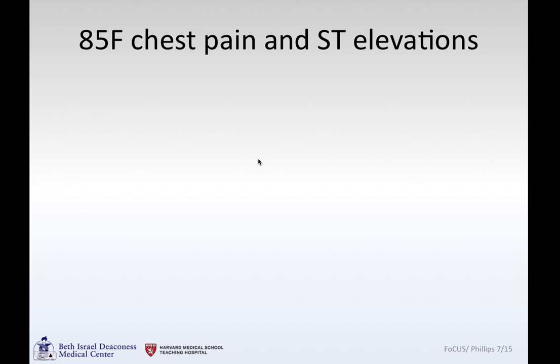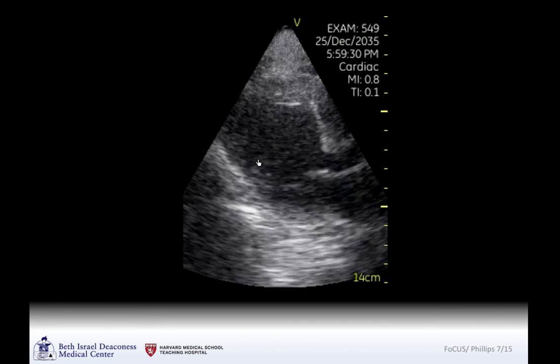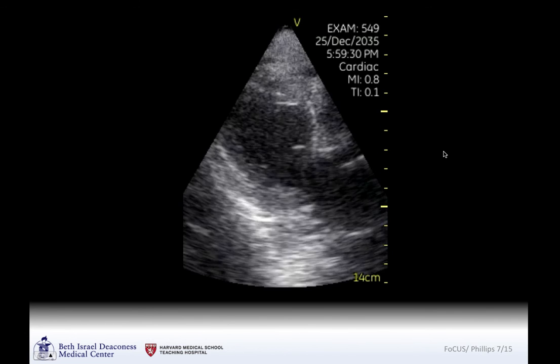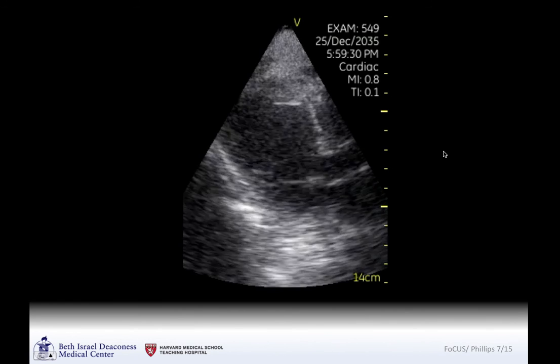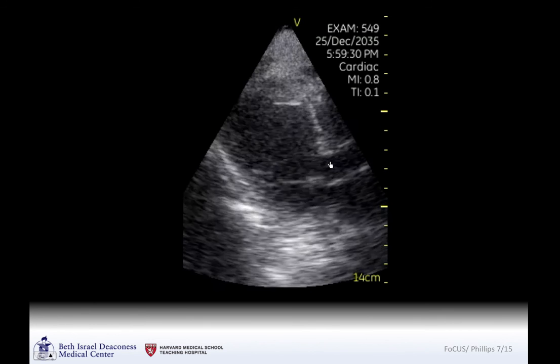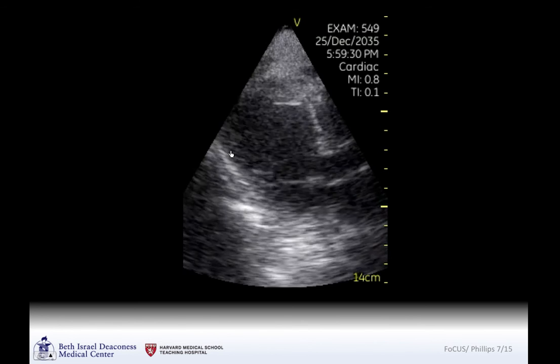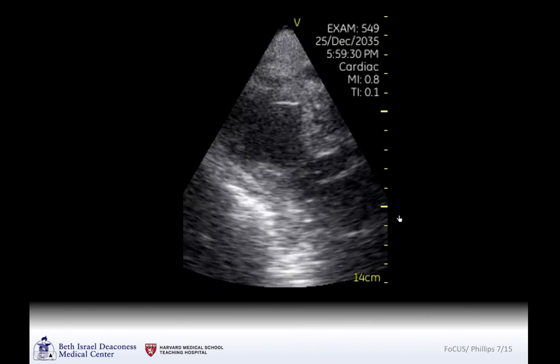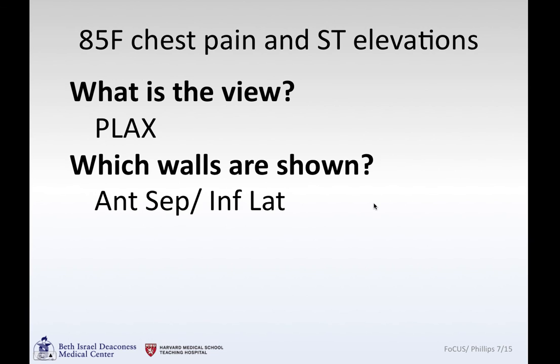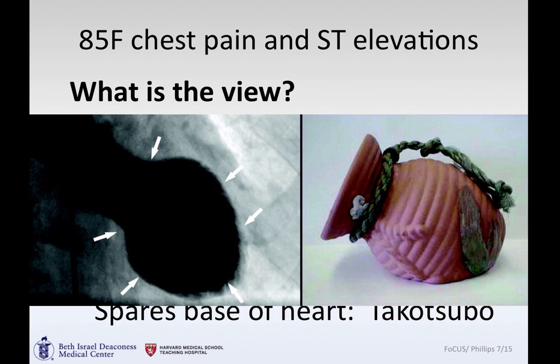Next: an 85-year-old patient who developed chest pain and ST elevations. She had experienced a death in the family, became very distraught, and then started having chest pain. Parasternal long axis view — the aortic valve and mitral valve are seen. The base of the heart is moving, but the apex is nearly akinetic. Depressed left ventricular ejection fraction sparing the base of the heart — this is classic Takotsubo cardiomyopathy. The ventriculogram, injecting contrast in an RAO projection, demonstrates the Takotsubo or octopus-catcher pattern.